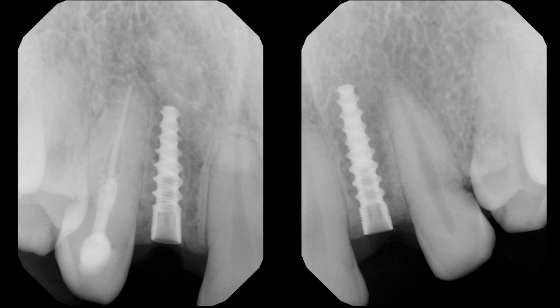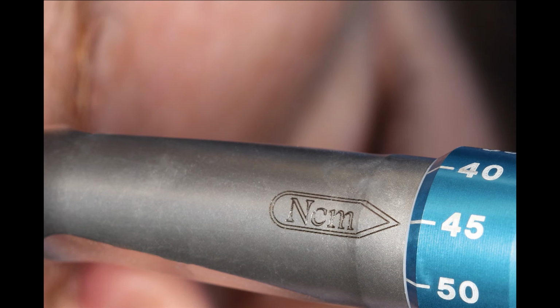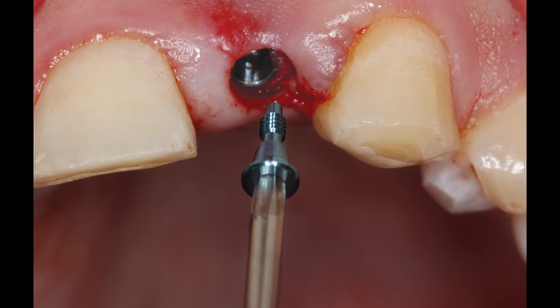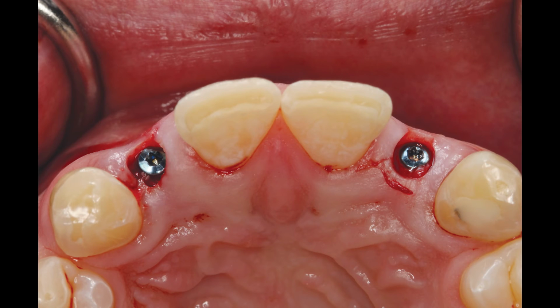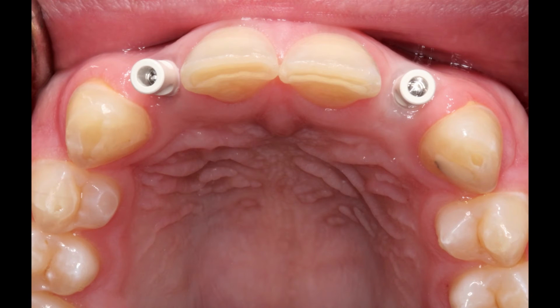Additionally, the implants feature prominent threads, which aids insertion into the undersized osteotomy site. The ability to place an implant in a slightly smaller osteotomy can help ensure outstanding primary stability. This is especially important where bone quality is not ideal. Cover screws were hand tightened into position so the patient could continue wearing his transitional appliance during the healing period. After approximately 4 months, the implants were uncovered.